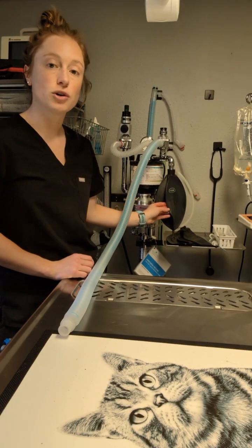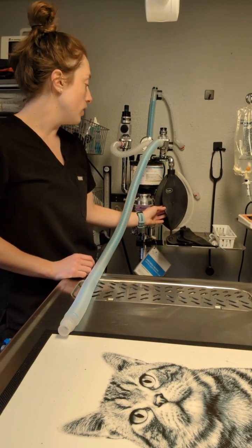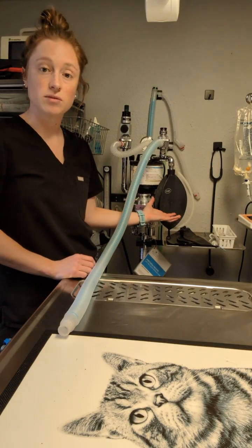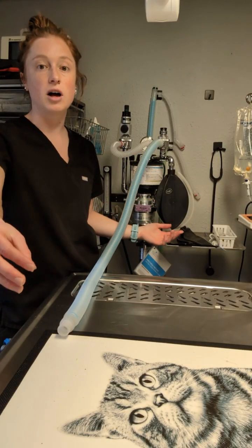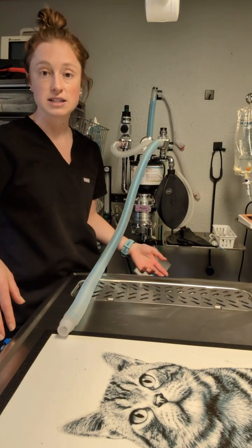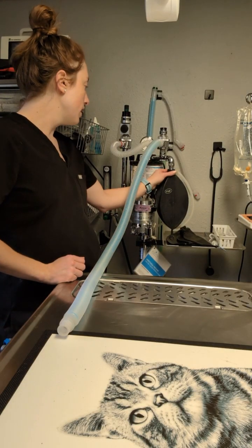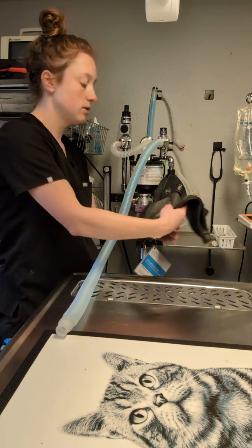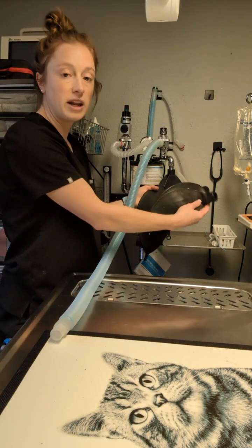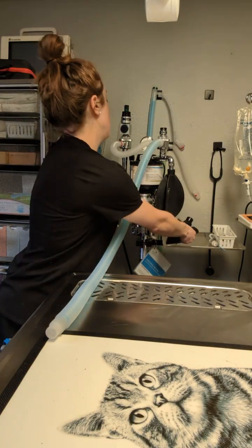So we can monitor respirations using movements in the reservoir bag. We can bag the patient. If we push on the reservoir bag, it will deliver a lot more of the gases into the patient, just kind of help them along. And then we have some different sizes of bags, which, depending on the size of the patient and the size of their lungs, we would adjust the size of the reservoir bag.